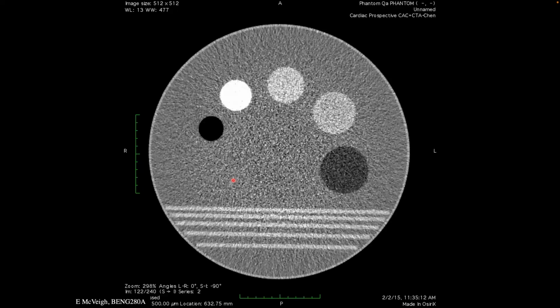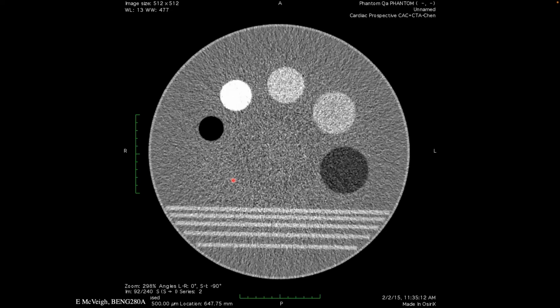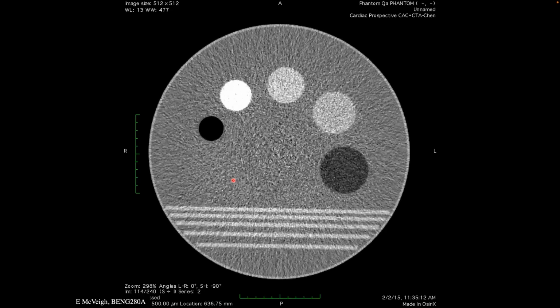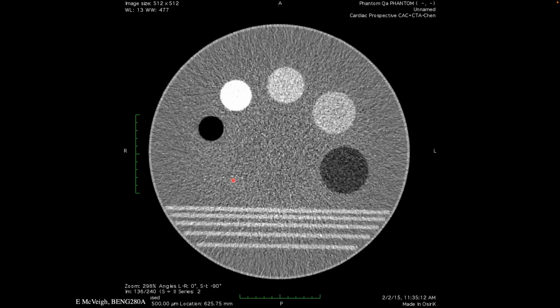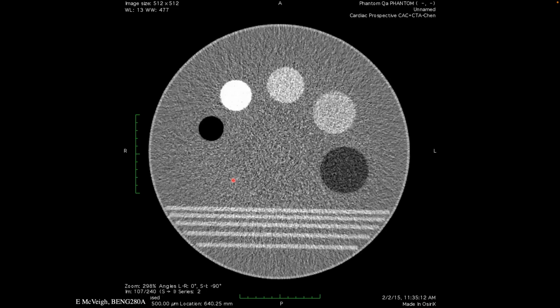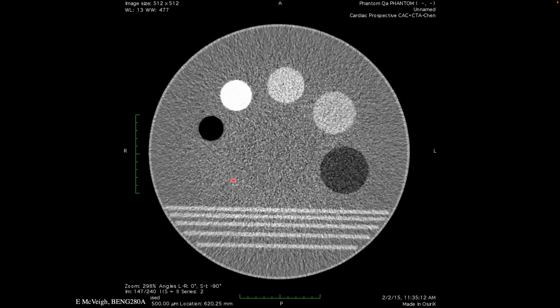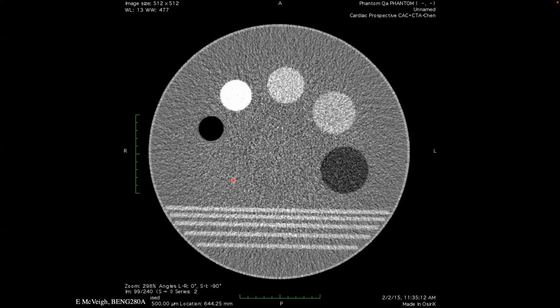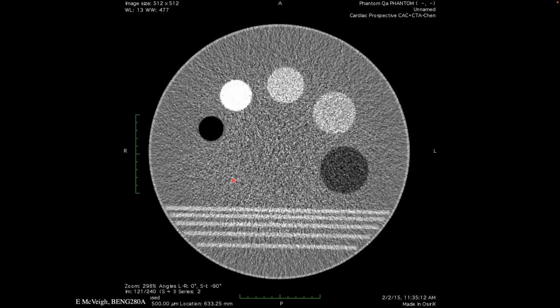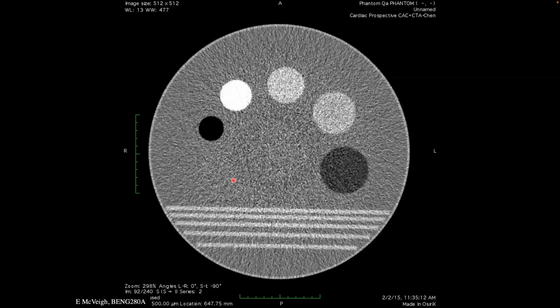And then you don't have any motion artifact or anything like that. So if I need to set my signal to noise at a higher level, usually I have enough juice in my X-ray tube just to turn up the X-ray tube. That's the way I would reduce the noise level. For the most part, on most CT scanners, you can provide enough X-rays that you would always do that.